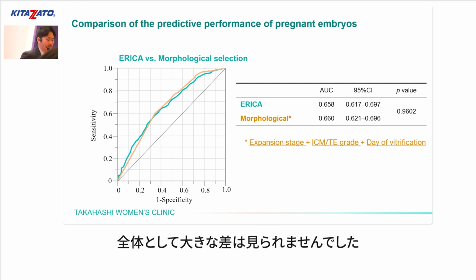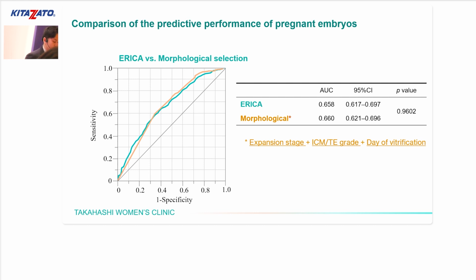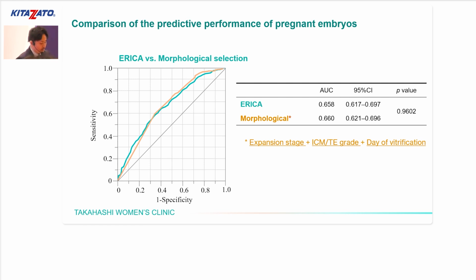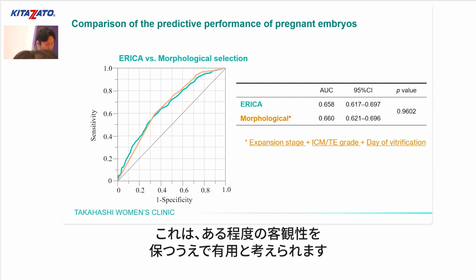Our results showed no difference in the predictive performance for pregnant embryos between ERICA and morphological evaluation. However, because ERICA is objective, consistent, and eliminates inter-observer variability, we believe it is useful to introduce ERICA into clinical practice.